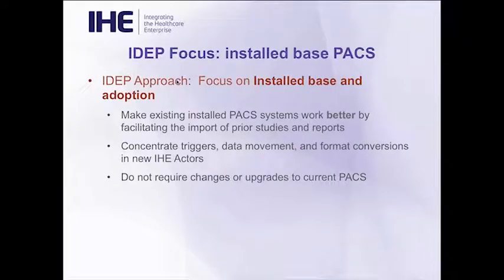IDEP has chosen to focus on the installed base and on adoption. The intent is that we make installed base systems work better, preferably without having to change them. We concentrate on this particular profile on the triggers and how to make things move around in an automated fashion. We have done quite a bit of work on format conversions, especially for reports. We'll get into that in a minute as well. But the intent is that we don't require changes or upgrades to current PACS systems, so that the adoption of IDEP will hopefully go much more quickly and much more smoothly.